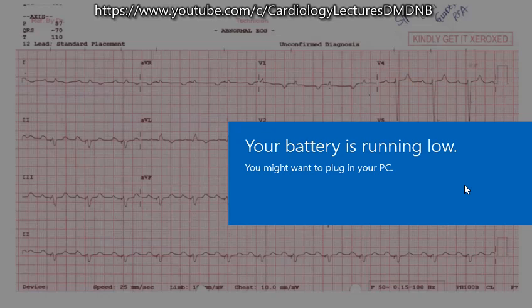You can see now it's BiV pacing going on, no PVC, a clean ECG, and after that it's been 2 years, there have been no heart failure related hospitalizations for this patient, and renal function has improved.